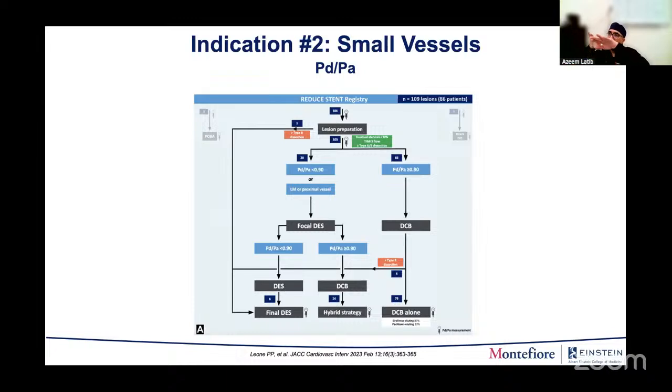Because otherwise, that hard calcium layer would just stay there. The drug's not going to get through calcium. It's not going to dissolve past it to get to the vessel wall. So I do think you need to debulk the calcium and break it, and get drug past it, so that as you develop new neointima in that area, you have an opportunity to cover that area, but not be excessive. That's kind of been my thinking.